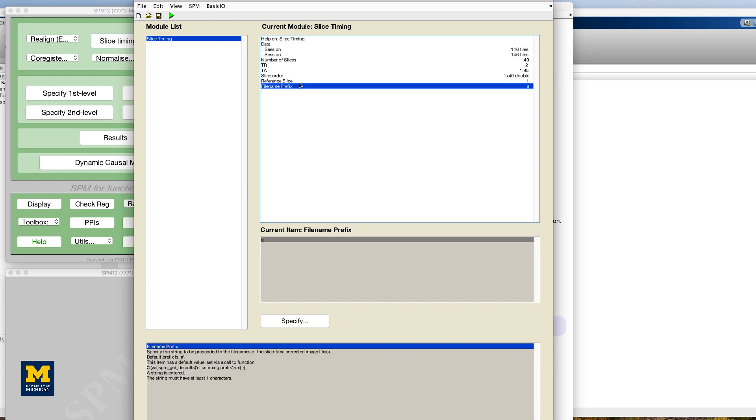Leave the file name prefix as is, which will prepend an A to the files that are generated. When you have finished, press the green go button. This should only take a few moments.